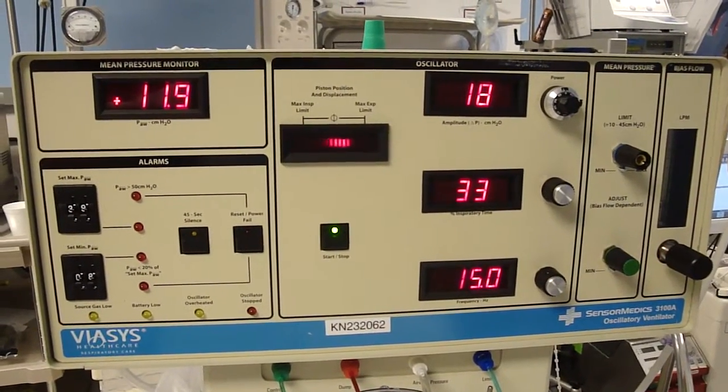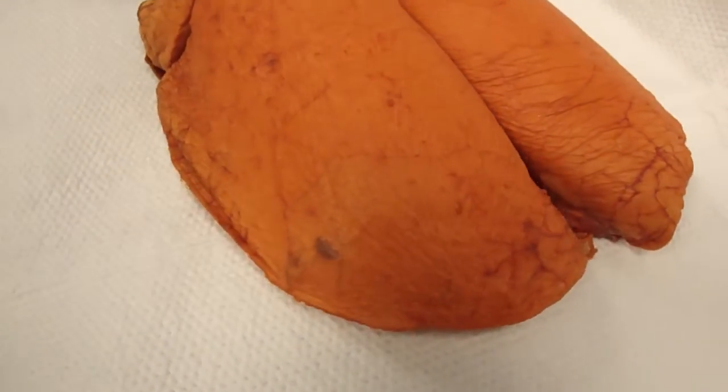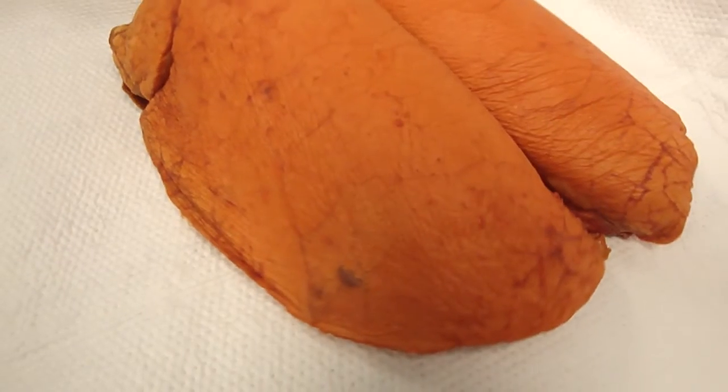Here is the oscillator running. As you can see, our lungs are well inflated and vibrating with the oscillator.